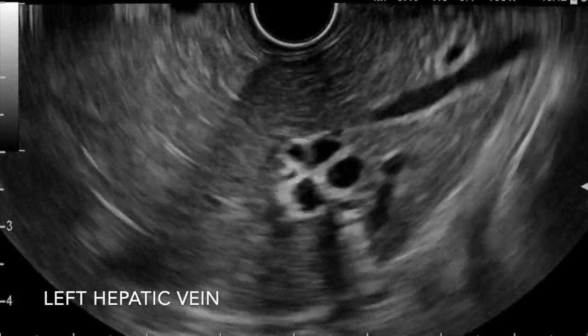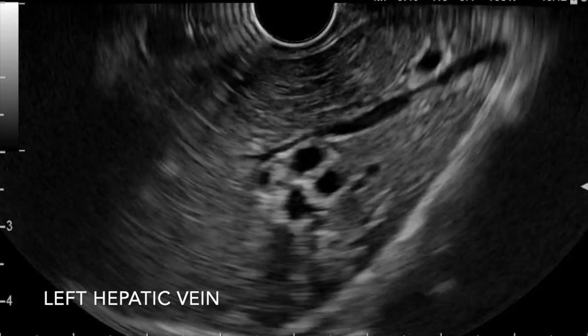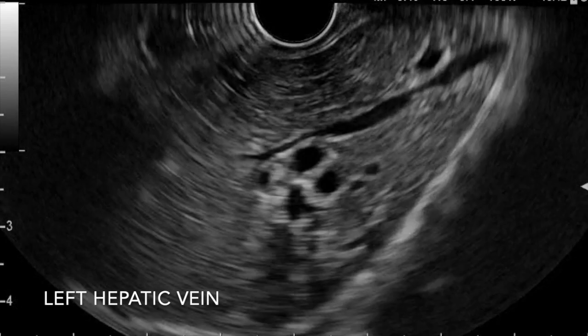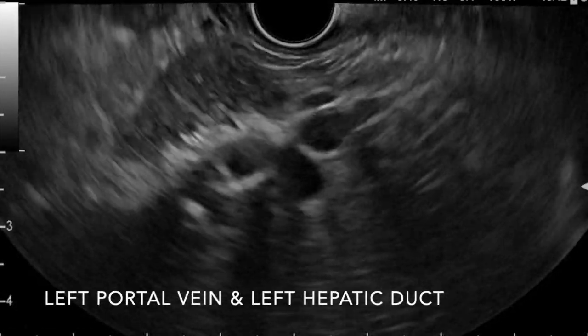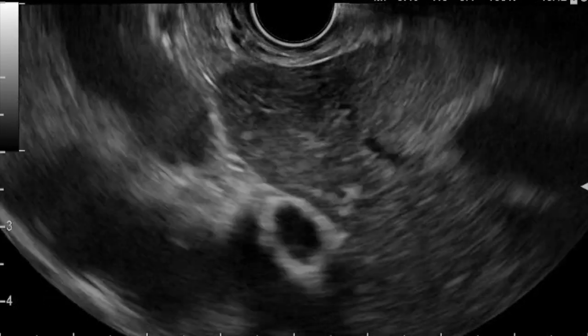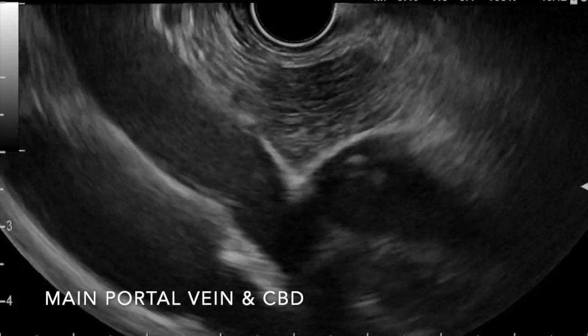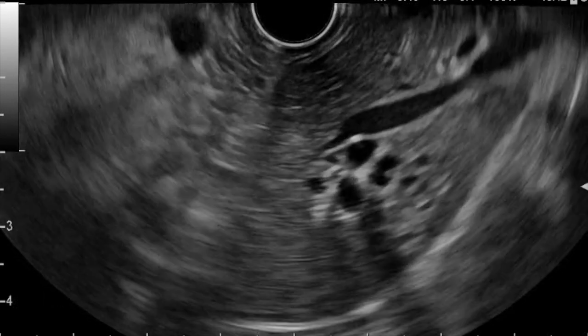Okay, so let's look at some EUS. Generally, the hepatic veins are seen in longitudinal direction stretching away from the IVC, whereas the left portal vein, the left bile duct, and sometimes the artery will generally be seen in cross-section and then become more linear in orientation towards the hilum as we enter the portal vein.